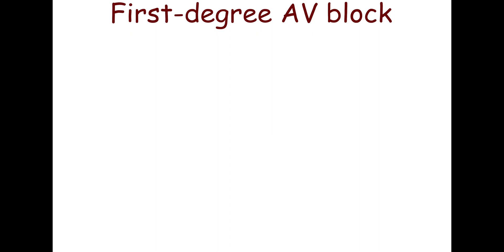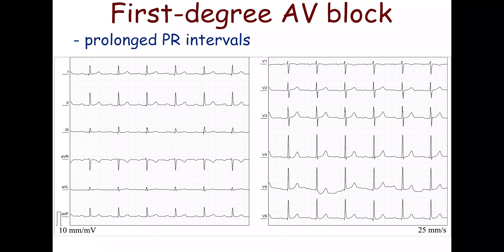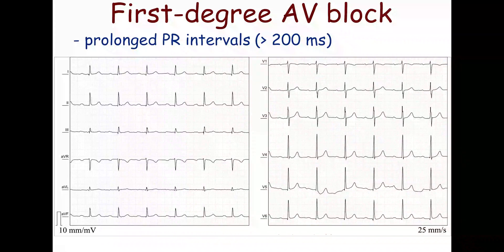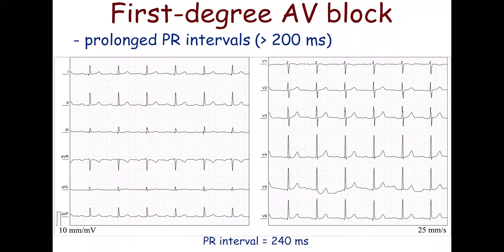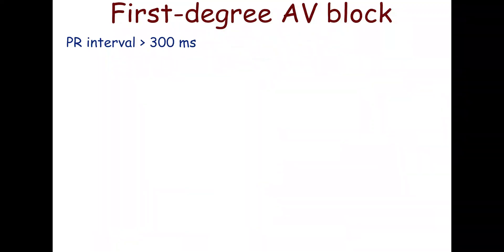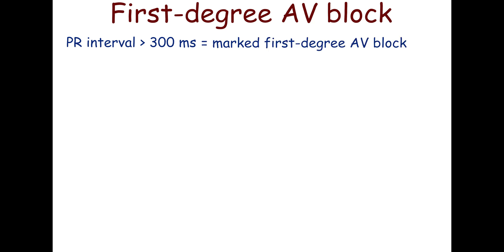First-degree atrioventricular block is characterized by prolonged PR intervals. The PR interval is greater than 200 ms. On this ECG, the PR interval is 240 ms. Prolongation of the PR interval to 300 ms or more is called a marked first-degree atrioventricular block.